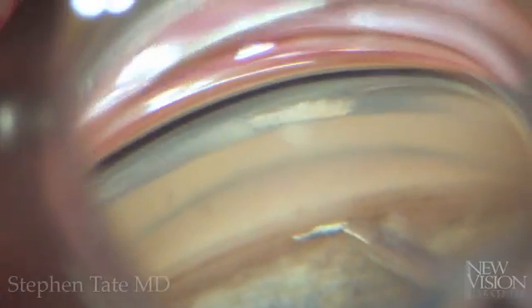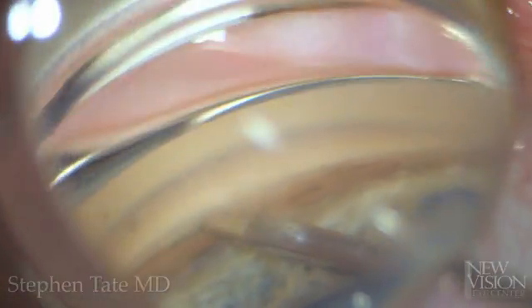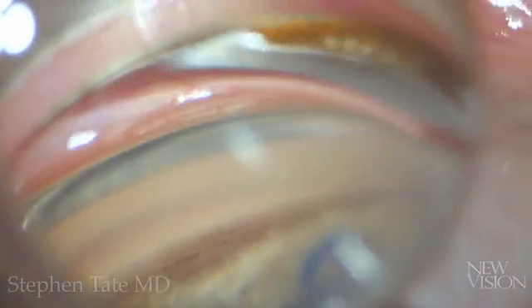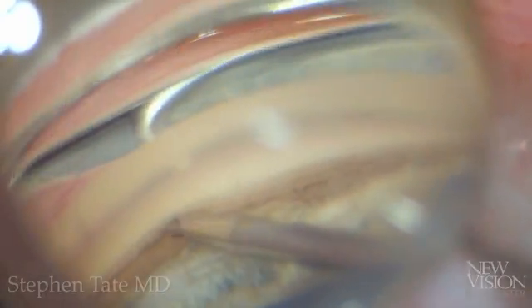The iStent injection technique used in the cases in this video employs a gentle sweeping technique to catch the delicate and slightly elastic trabecular meshwork on the tip of the iStent. Once the tip of the stent is engaged, it is usually easily advanced into the canal. It is best to avoid trying to aim the stent posteriorly into the canal, as this can result in the stent becoming lodged in the posterior wall of Schlemm's canal. Once the tip of the iStent has pierced the trabecular meshwork, a gentle lift of the inserter tip centripetally can also help avoid impaling the posterior wall of the canal.